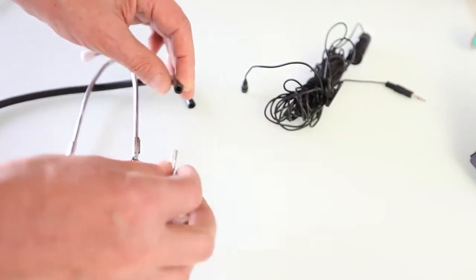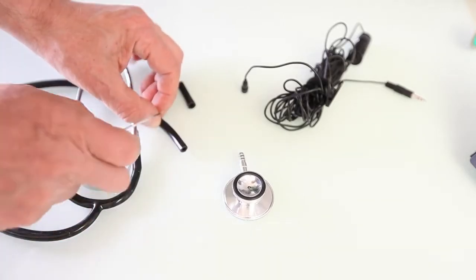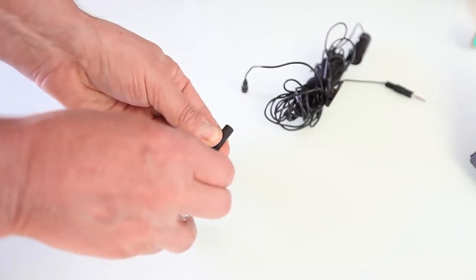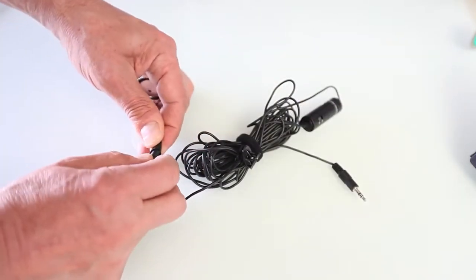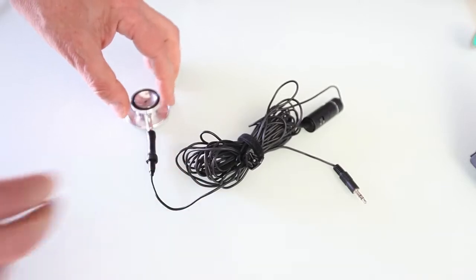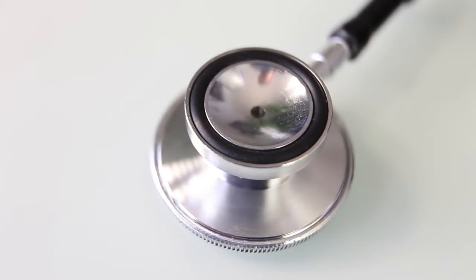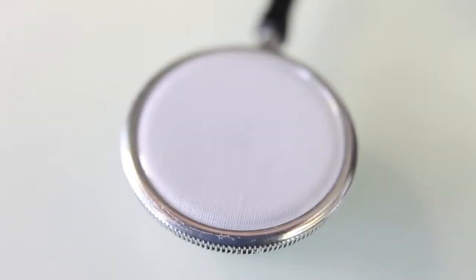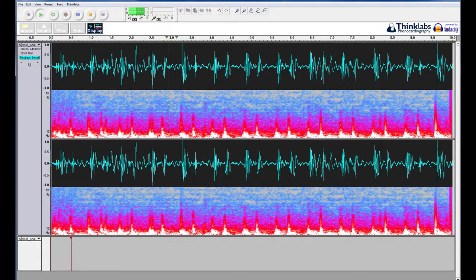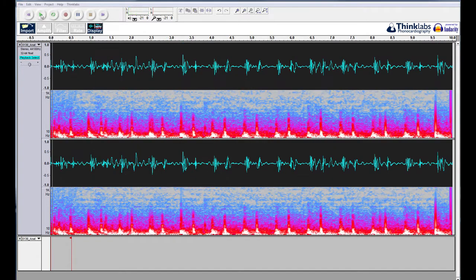We will attach the microphone to the chest piece of the stethoscope using a short piece of tube. The bell part of the stethoscope will be used for recording. The diaphragm can also be used. In an ordinary acoustic stethoscope, the diaphragm is used to filter low-frequency sounds and to emphasize high-frequency sounds at the expense of their amplitude. However, in our case, we can use software to amplify various frequencies and to remove some unwanted high frequencies.